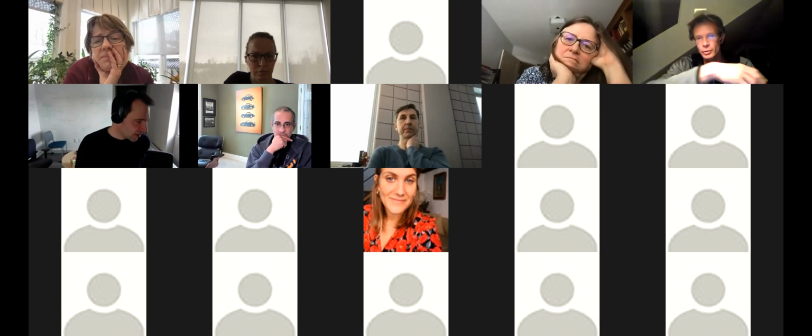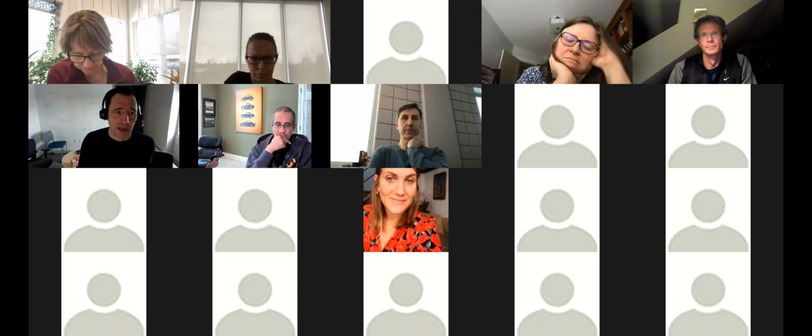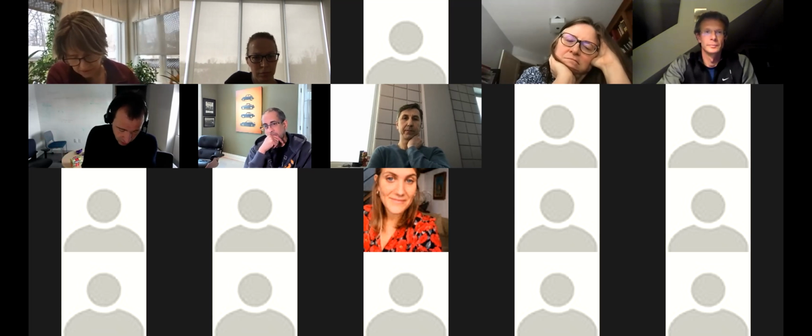Otherwise, you could do the crazy thing like I do in the Human Connectome Project and do a factor 8 slice acceleration. For multi-echo to have really beneficial circumstances at 7 Tesla, say, normally you have an echo time of, what's our standard echo time right now at 7T? About 20 milliseconds. And so which echo times would you recommend, Ben, at 7T?